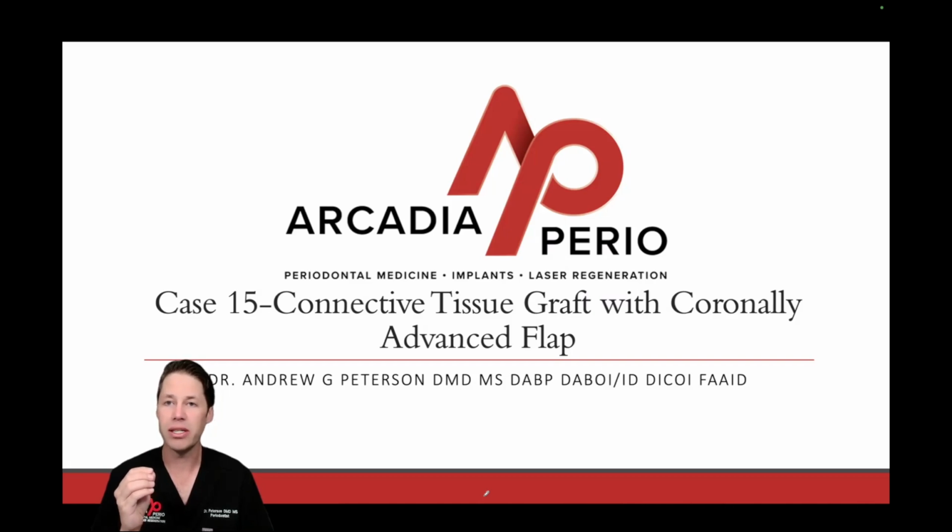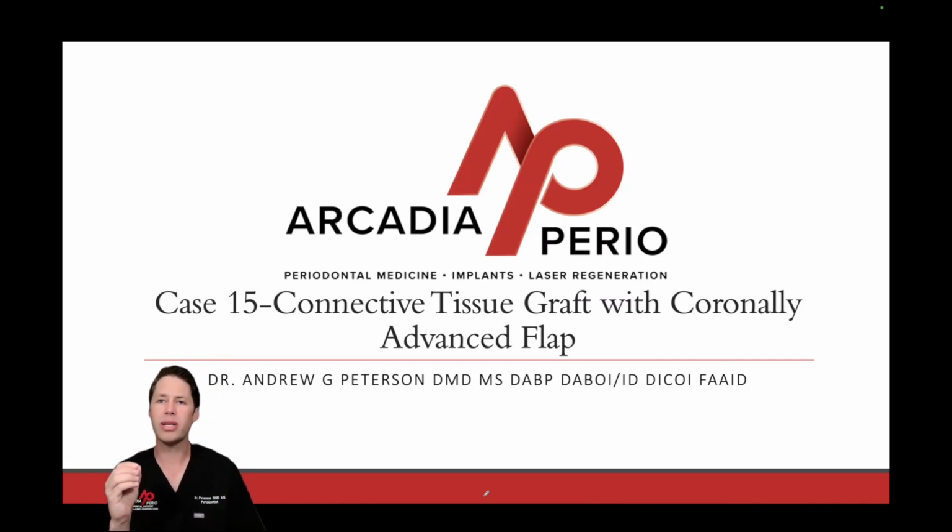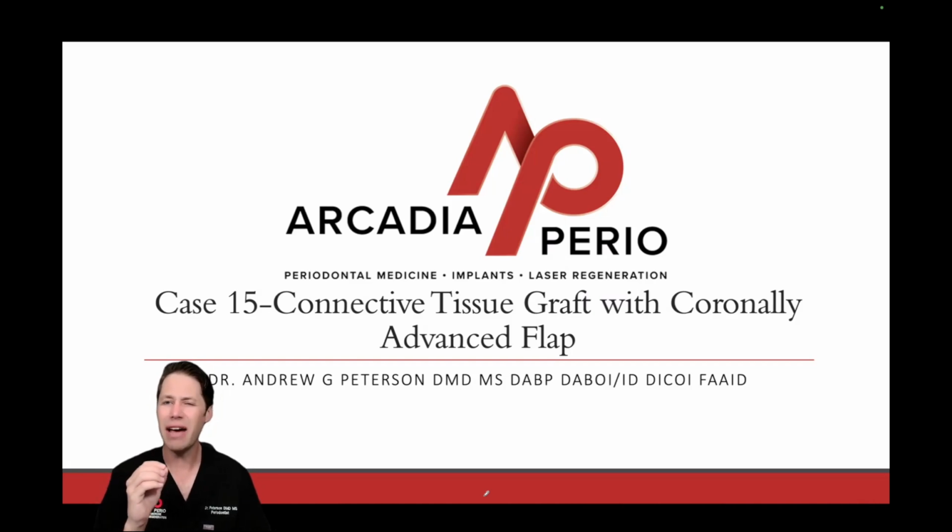Planning complex interdisciplinary cases. Today's case is connective tissue grafting with a coronally advanced flap. Do you struggle with diagnosing and treatment planning mucogingival defects, or do you struggle with referring these types of cases over to a local periodontist? Well, then this case is for you. So sit back, relax, and let's dive in on this quick tutorial on connective tissue grafting and coronally positioned flaps and how I suture these types of cases.